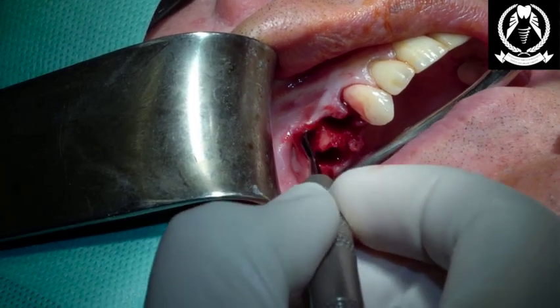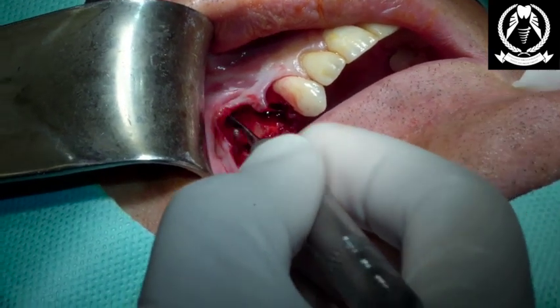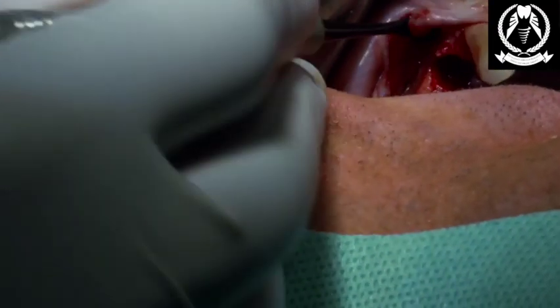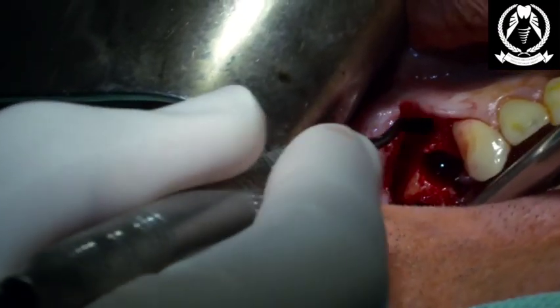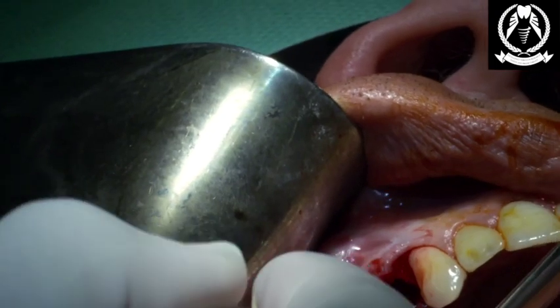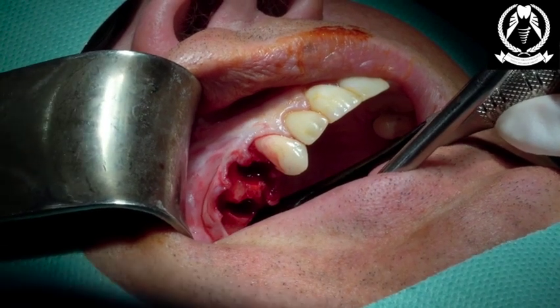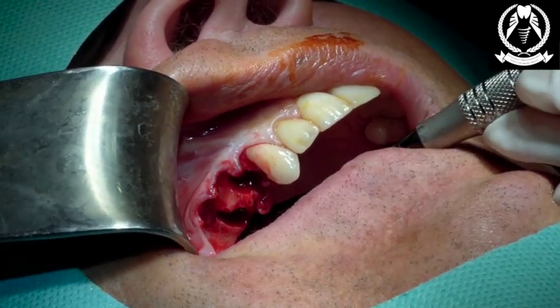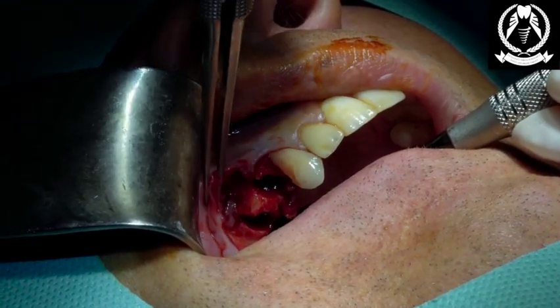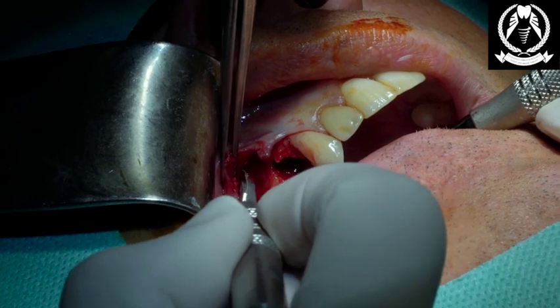So I have a good overall view of that bone, and we have a little bit of an infection on the front there. Now, I don't generally like relieving anteriorly too much. Just like to do that. Alan, how you doing? Yeah, good. Looking awesome. Yeah, and then we're just going to see there is a cyst. So what we're going to do with the cyst is I'm going to ask my assistant just to hold out the retractor there, and you've got a separation of granulation tissue from the gum tissue. So I'm just going to gently dissect that away from the gingiva.